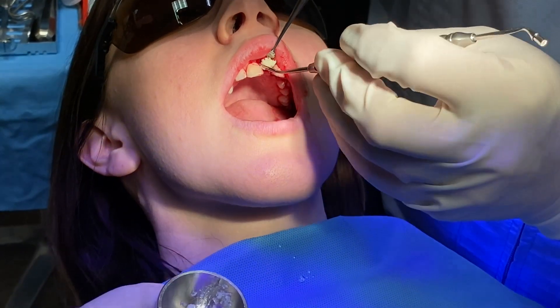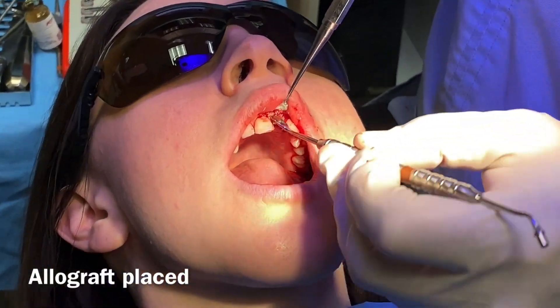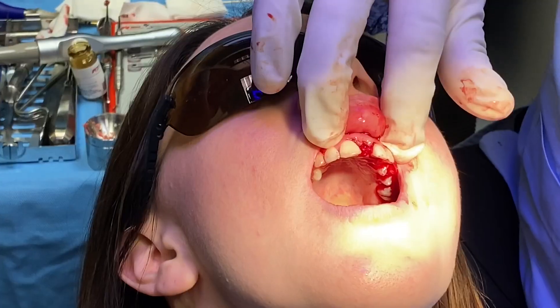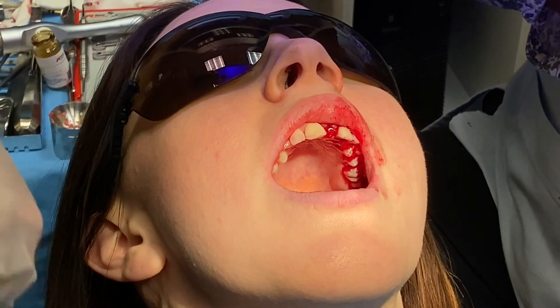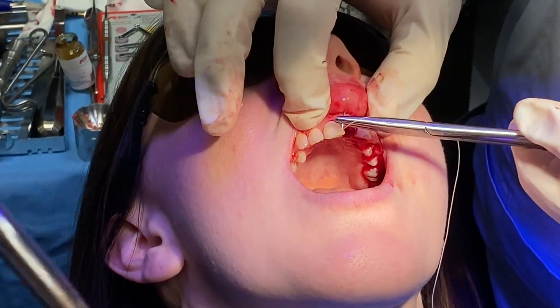Now we'll put a little bit of allograft in. This allograft is going to help enhance the area and build up a little bit more. We're going to close here and do a second stage surgery in about four months, and we'll come back in.